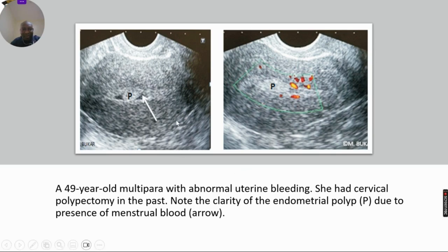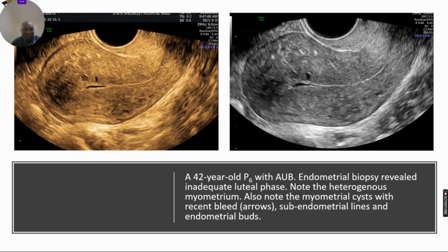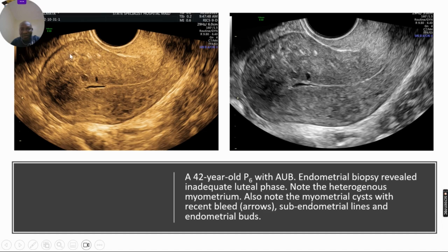The patient seen earlier actually presented while she was menstruating, so it was the menstrual blood that clearly delineated the polyp — here you can see the polyp with pedicle flow. Another patient presented with abnormal uterine bleeding with failed medical treatment. She had a biopsy showing inadequate luteal phase. She was scanned while still bleeding. You can see the uterine cavity and a cyst within the myometrium with some strands inside, suggesting recent bleed. You can see the heterogeneous myometrium and myometrial cysts.